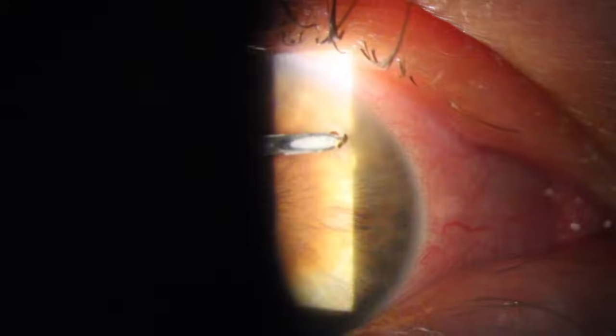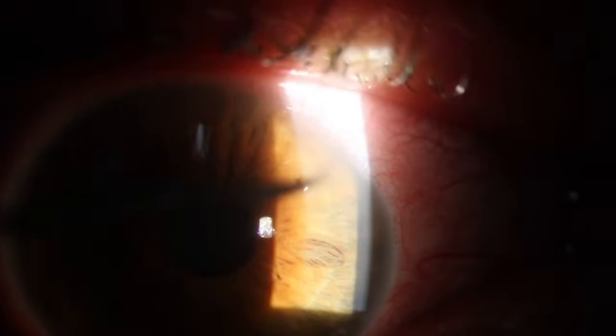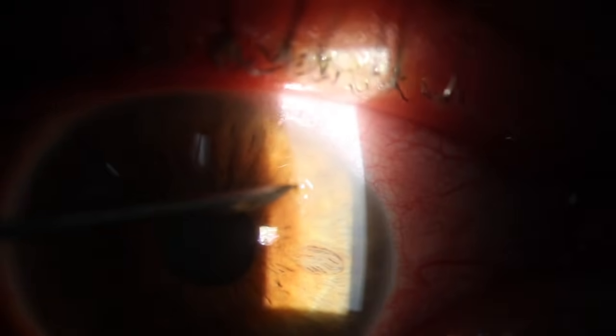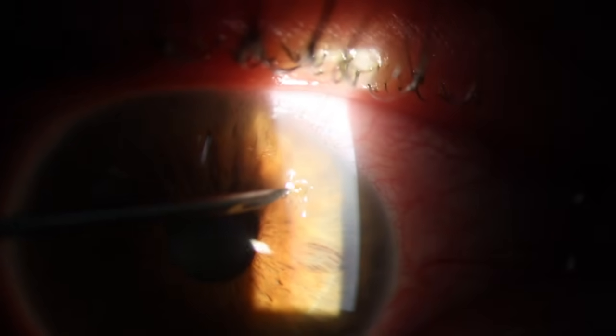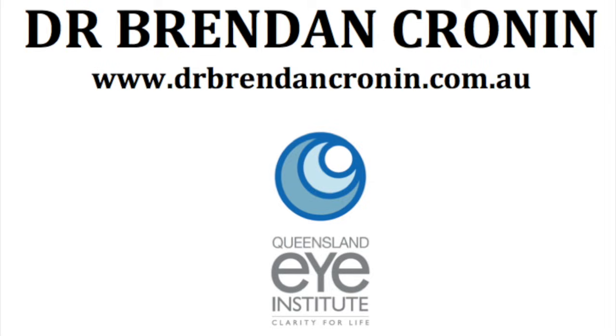It's important to caution all of these patients about the importance of safety eyewear to ensure they don't get a nastier injury next time. It's also important that the fornices are examined thoroughly and the upper lid is averted to ensure there's no hidden foreign body.